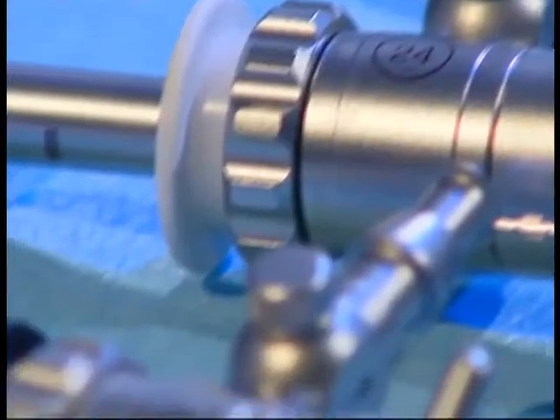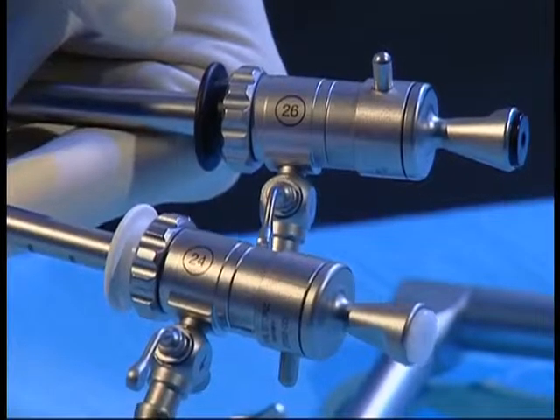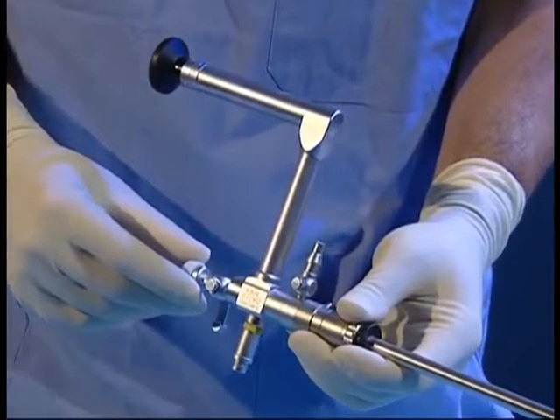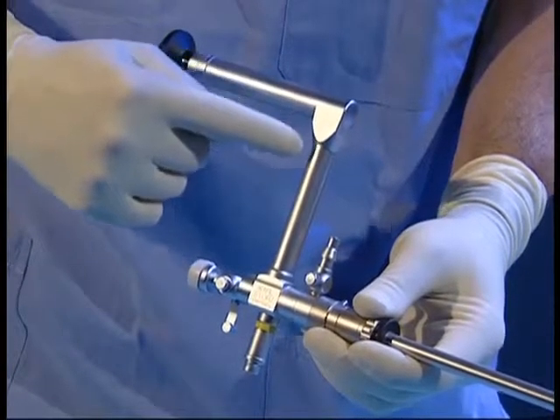The standard nephroscope has two sheaths, size 24 and 26 French, and two different lengths, 19 and 25 cm. The wide-angle, straight-forward telescope has a parallel eyepiece with a 6-degree angle of view. An angled eyepiece can also be used.